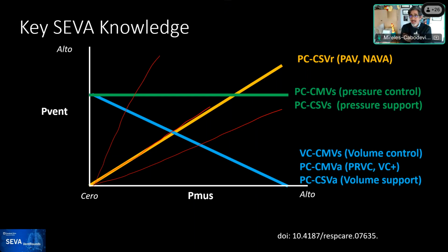Yeah, and I think that it helps you make decisions, especially when you're trying to come to terms with what your goal is with mechanical ventilation. And I think that's where we're going to end, and this talks a little bit about that baseline level of support. The minimum amount that you set on the ventilator is the minimum that the patient is going to receive with each breath that they trigger, or if they're not triggering, with what the ventilator is doing.